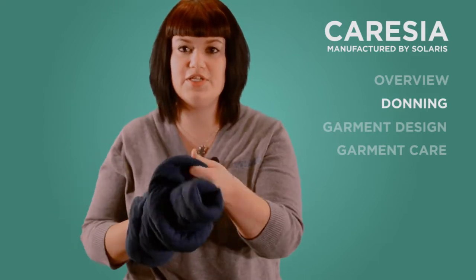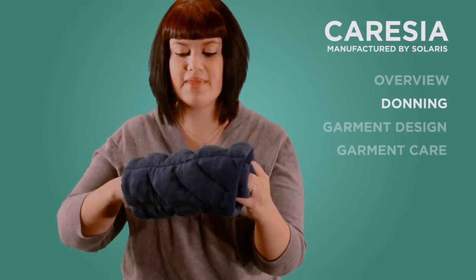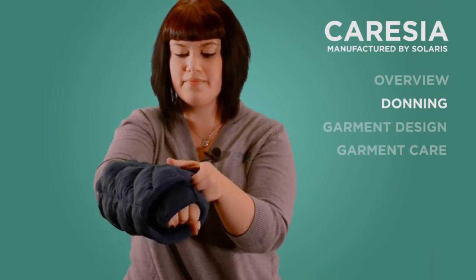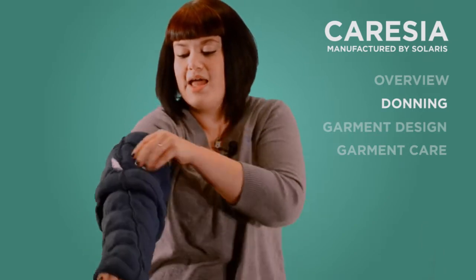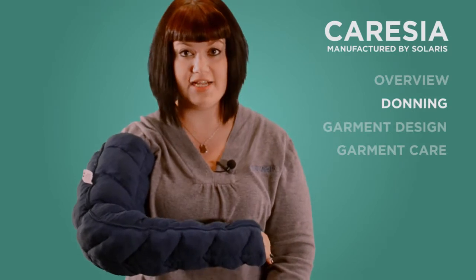So the patient would just have to roll this in half like so, and then pull it on. There is a thumb hole, so make sure that they get their thumb through the thumb hole. And then they're going to roll it up the limb. And that's it. And then they just put one layer of short stretch bandaging over the top.